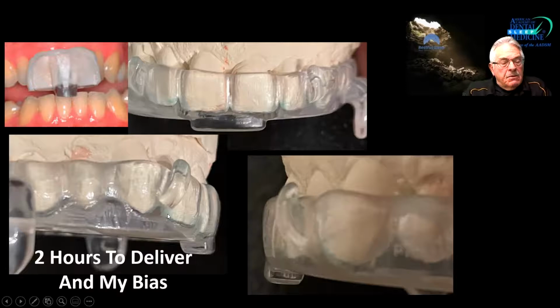This happens to be not my appliance, but it's an appliance that another dentist had contacted me about. Took them 2 hours to deliver this, which is a totally different type problem. But when we look at the anterior discluder that they built on this, you can see it's not out very far, which it doesn't have to be. This appliance had to go back to the lab for a variety of reasons.